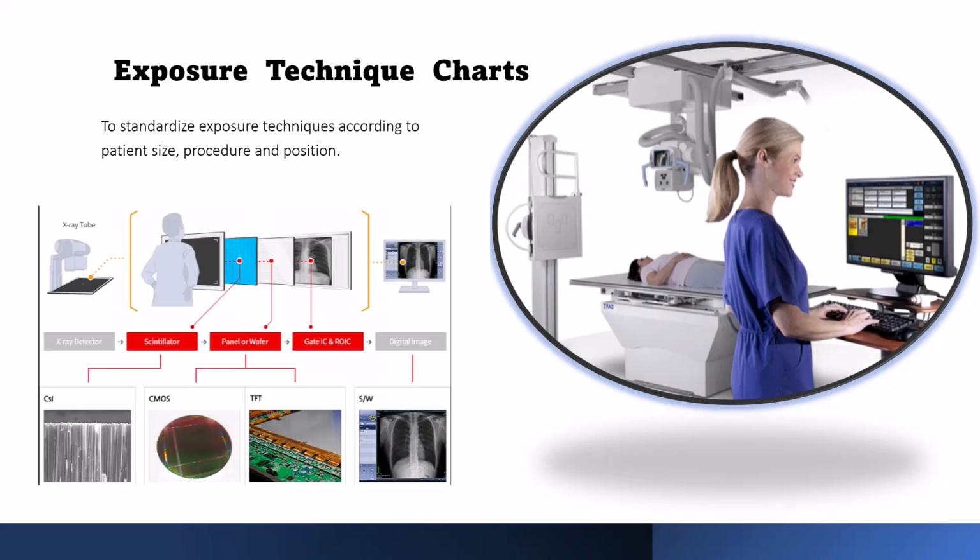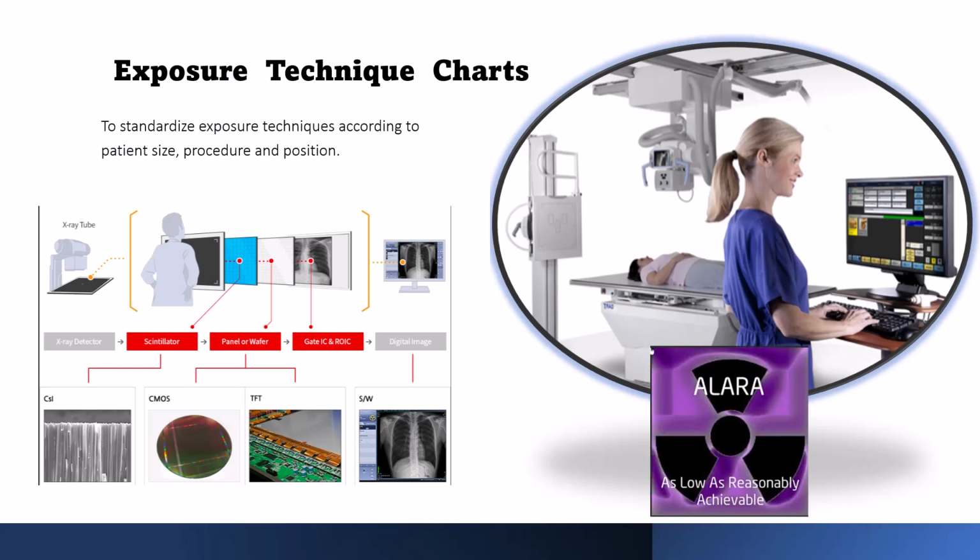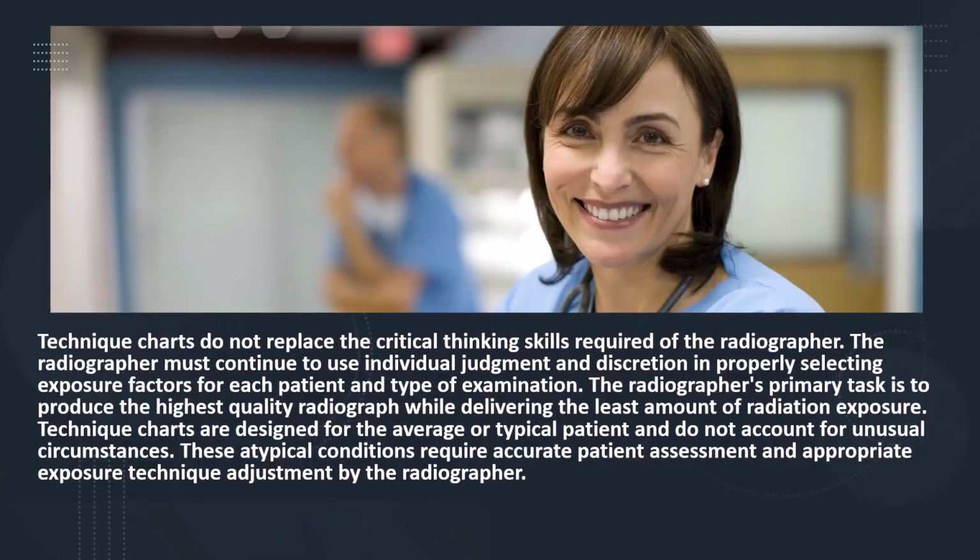Appropriate use would be the correct selection of kVp, mA, grid, and SID that produces an acceptable level of radiation under the standards of the ALARA, as low as reasonably achievable, principle, and also provides the best diagnostic quality image.